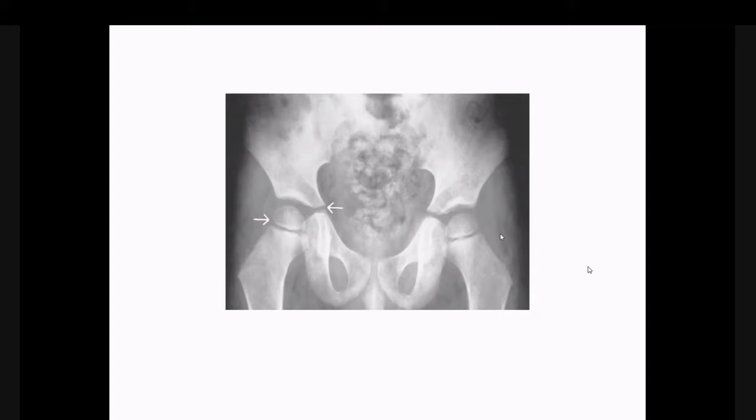Like if we want to see the bony development in the hip or pelvis joint and we are just acquiring a right hip view only, that is not going to work. We have to acquire both views, right and left, in combination, so that we can compare both views in one radiograph, and that will be easy for the physician and the radiologist to report, and definitely give better image and better diagnosis for the patient.